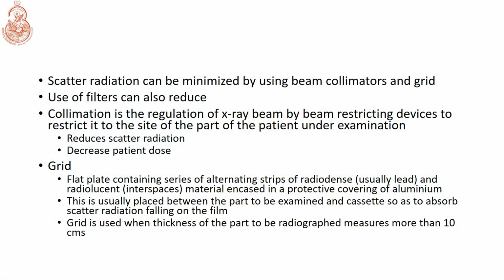So, these are alternating strips of radiodense and radiolucent material, and the radiodense material is made of lead, and it would look something like this.